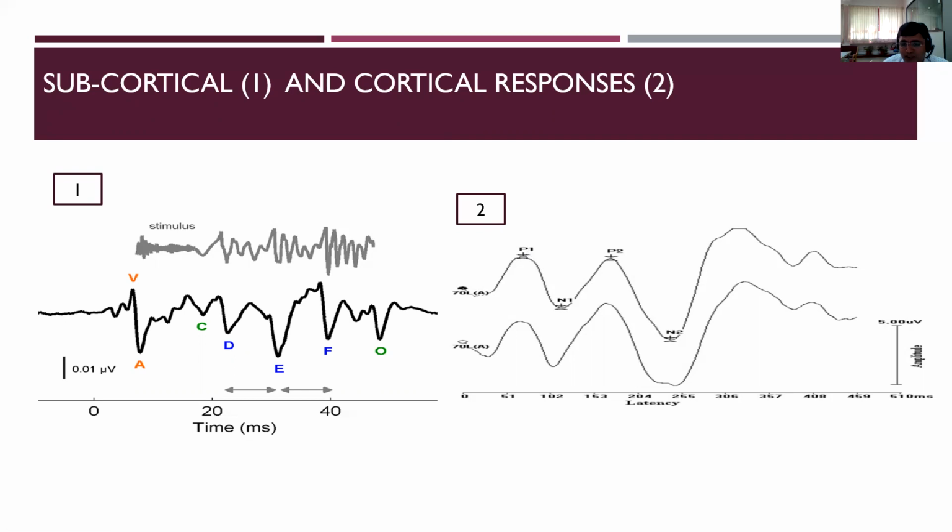It is used in hearing impaired hearing aid users, to see whether the hearing aid is beneficial or not. It is also used for cochlear implantees to see the progress as well as in candidacy. Basically there are 4 peaks, P1, N1, P2, N2, and this graphical representation helps the clinician to understand whether cortical potential is there or not.